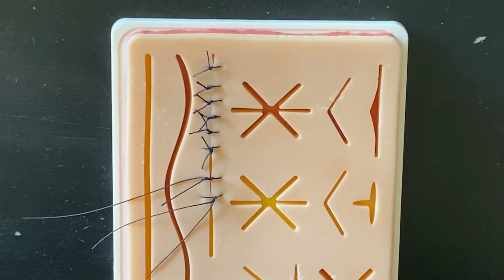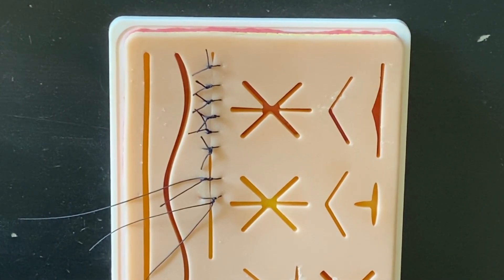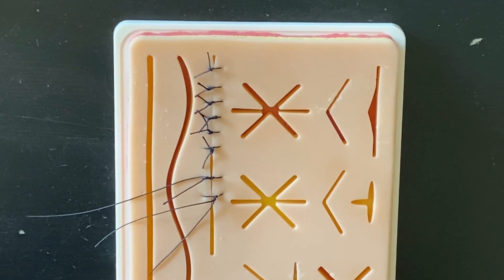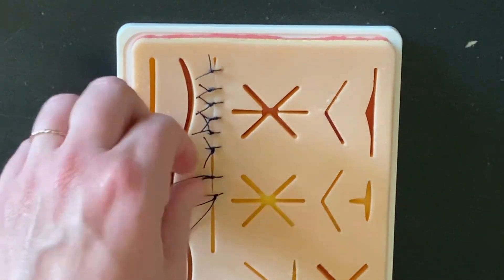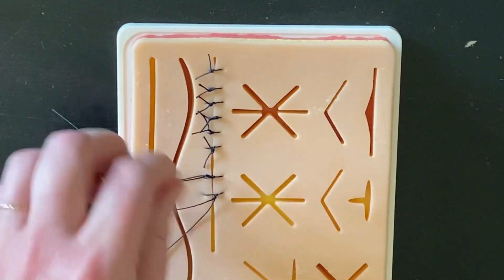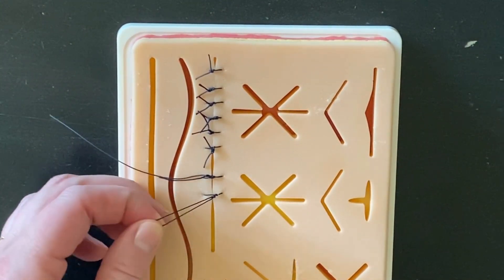This video will focus on some of the basics of suture cutting and removing sutures. I've left two of our sutures here longer to give you an example of how I approach cutting sutures.